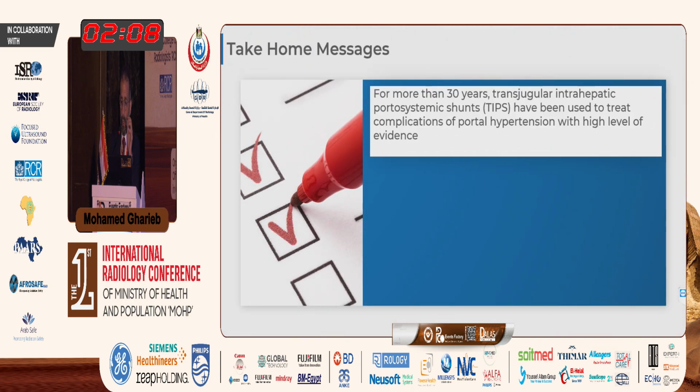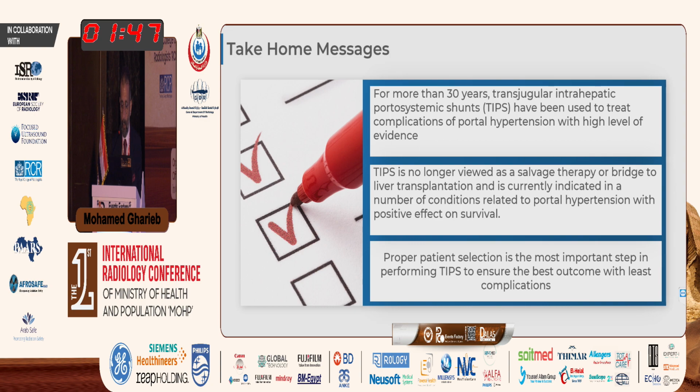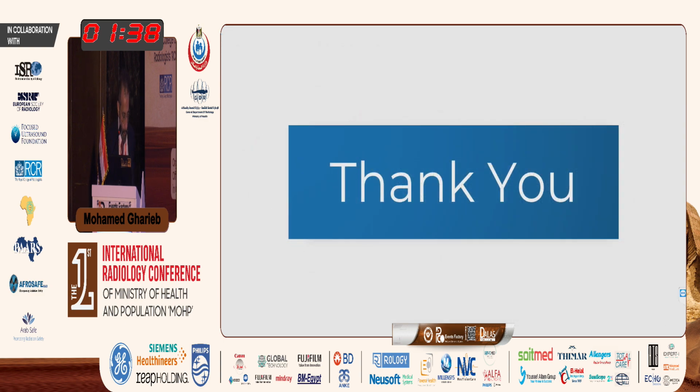TIPS has now been widely used for more than 30 years to treat various conditions in patients with portal hypertension. It's no longer viewed as a salvage therapy or bridge to transplantation. It is indicated in several conditions, mainly Budd Chiari, to relieve the portal hypertension with positive effect on survival. Proper patient selection is the most important step in performing TIPS to ensure the best outcome with least complications. And thank you very much.